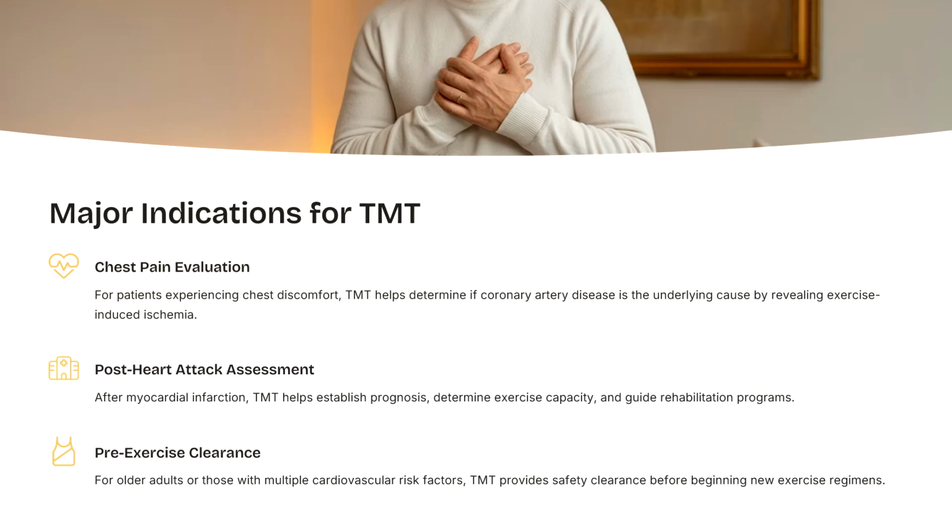What are the major indications for TMT? Why will a person go for TMT? Number one, chest pain evaluation. If a person feels some chest pain or discomfort in the chest but doesn't know the basic reason, then this person may go for the TMT, where the underlying reason will come out.